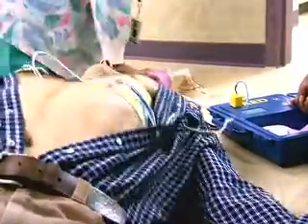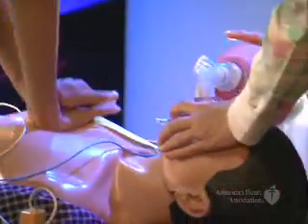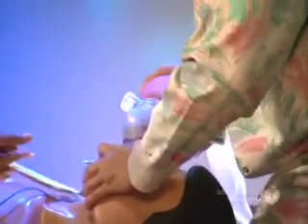I'm clear. You're clear. Clear. We're all clear. When the shock is delivered, the victim's muscles will jerk. The AED will then tell you to start CPR, beginning with chest compressions. Begin CPR.